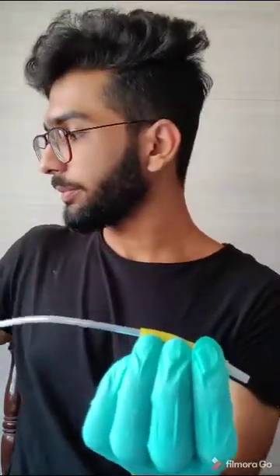We will slowly open the regulator for checking the fluid. The drug needs to be in the tube, and no amount of air should be present. As I open the regulator, as you can see, the air is coming out of it. Yes, at this point we need to close the regulator again and open the scalp vein set other end, and put it like this, and you can gradually open the regulator so as to allow the drug to pass.